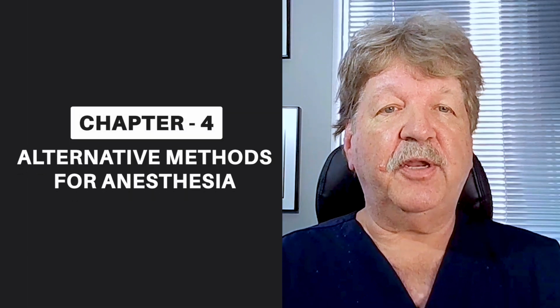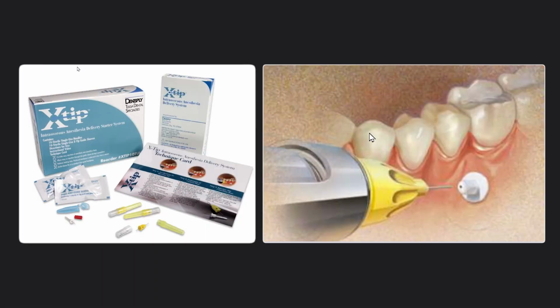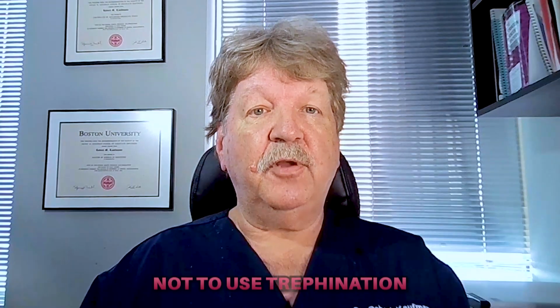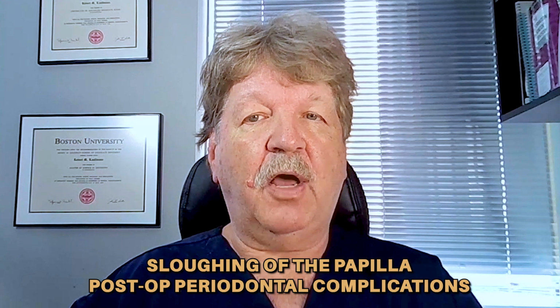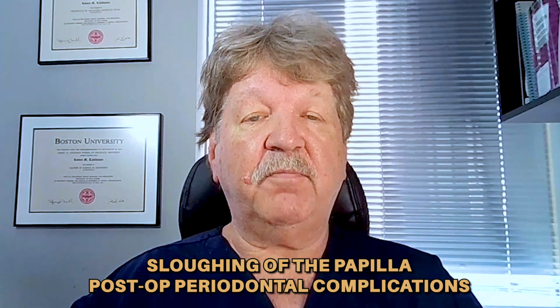An alternative method is to use a totally separate device, such as a dedicated intraosseous system, such as the X-tip. I've used it, but I find that the PDL method is just as effective and far less cumbersome. I prefer not to use trephination on the buccal plates during anesthesia. There've also been some reports of sloughing of the papilla or post-op periodontal complications as a result of the use of this device, though I must admit they're rare.